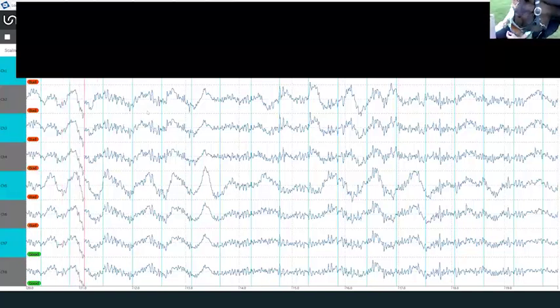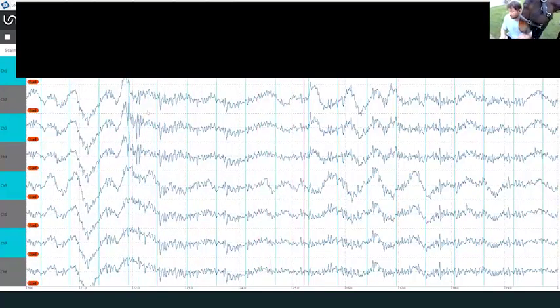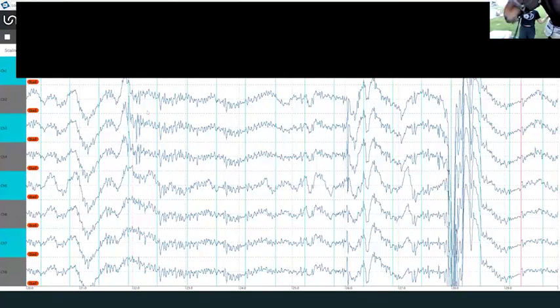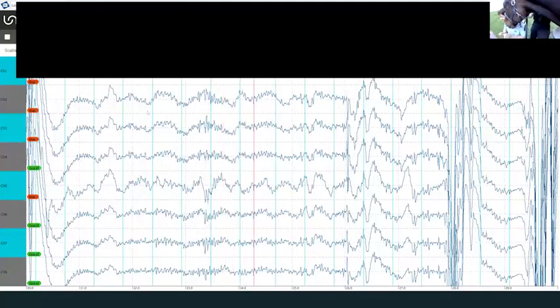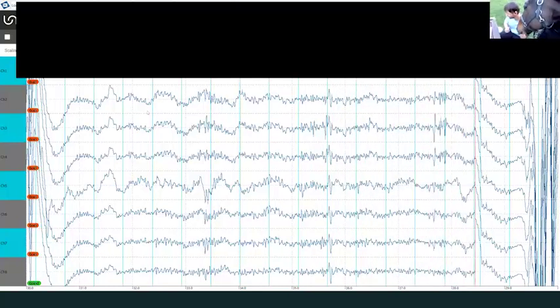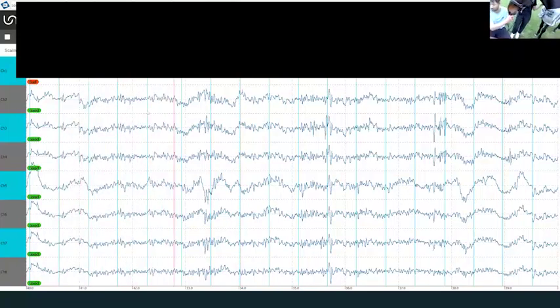Look, Dreamy already recognizes the sound because we did that experiment quite often. And she is excited because she wants to have some treats after the experiment. For now, she needs to wait a bit at least. But I will give her a treat.